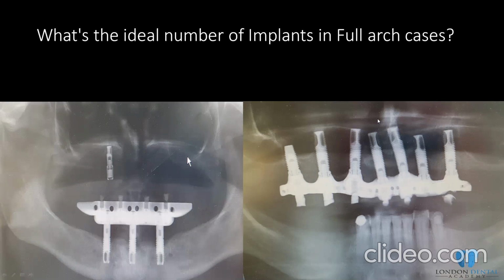Do you use the same occlusal scheme on conventional and implant overdentures? Yes, the answer is yes. We use it on implant overdentures and conventional dentures because they are the same. So there is no difference at all.